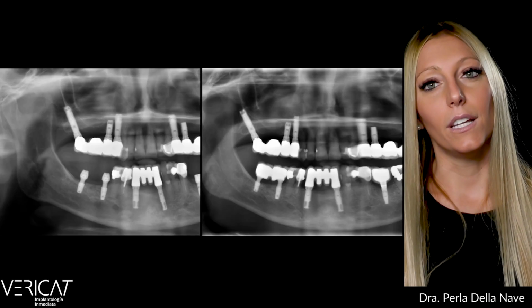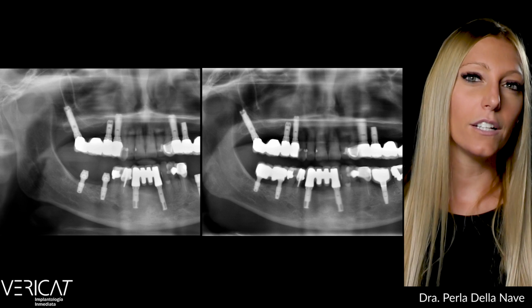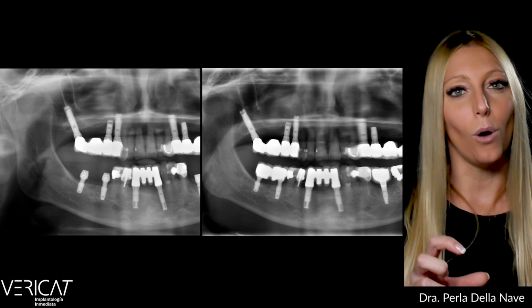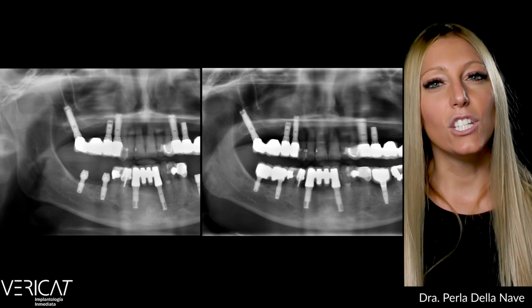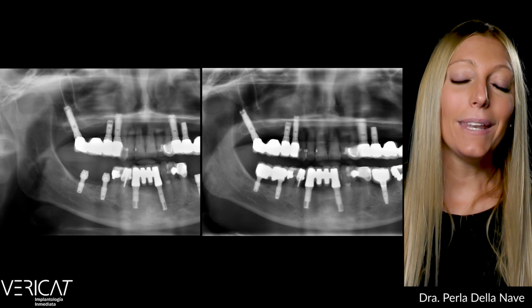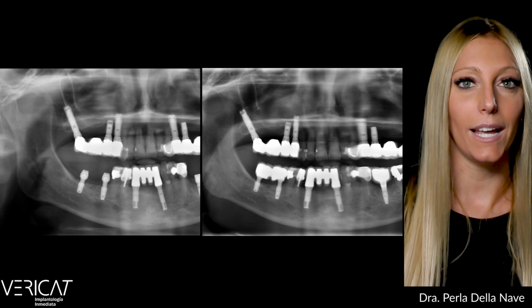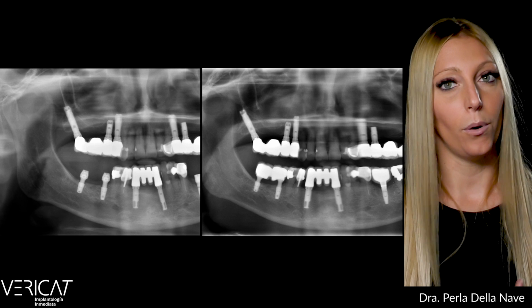Another example on the right mandibular side. In this case, we can observe a small difference. These are 2 short parallel walled implants. In particular, the posterior 6 mm implant, due to the limited bone vertical availability in the posterior mandibular area, was positioned at just 1 mm subcrestal depth. And we can see that here the minimal remodeling of the marginal zone is somewhat more evident. So we don't have here the safety margin we like. Still, the implant is fully protected, and after 2 years the image is absolutely positive.